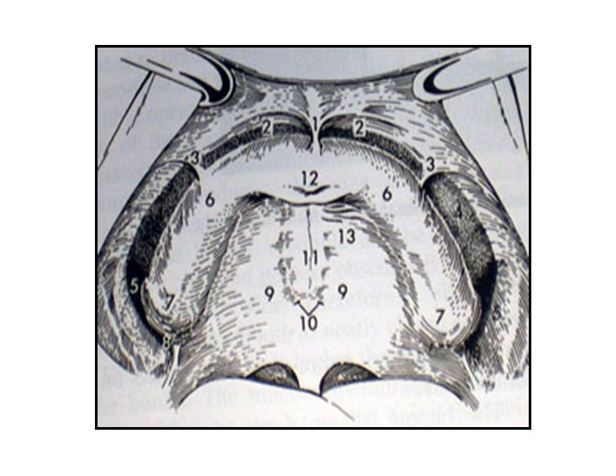There are several structures in the maxillary arch with which you should be familiar. These structures will be recorded in your impression.